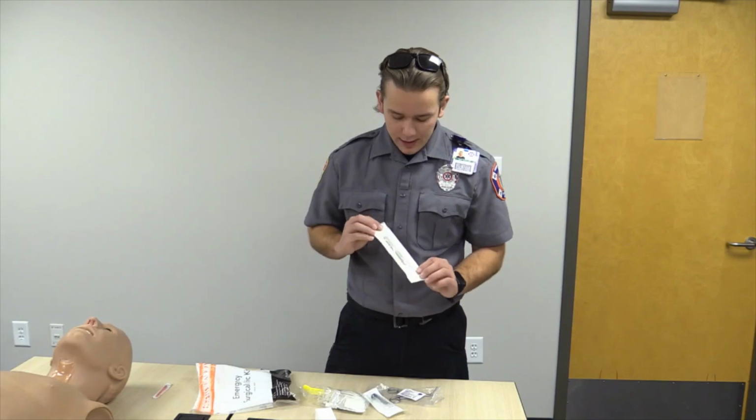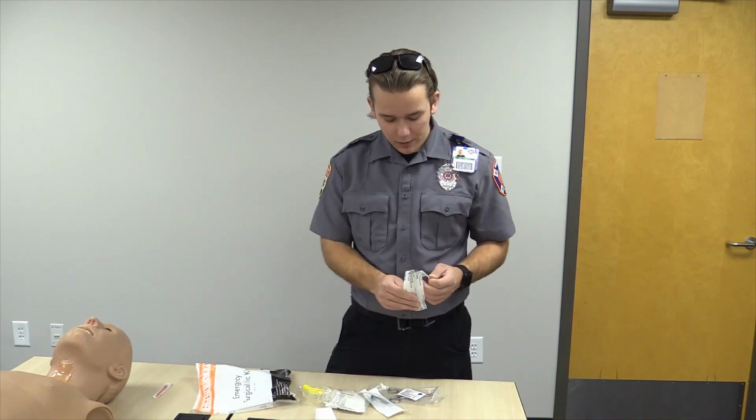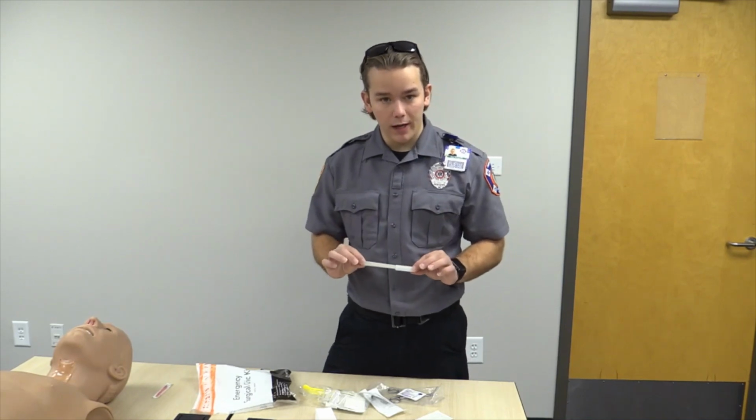This is going to come with a scalpel. One thing I want to point out with the scalpel is it's not our traditional scalpel. This is not a retracting scalpel. This is just a capped scalpel, so keep that in mind for safety.